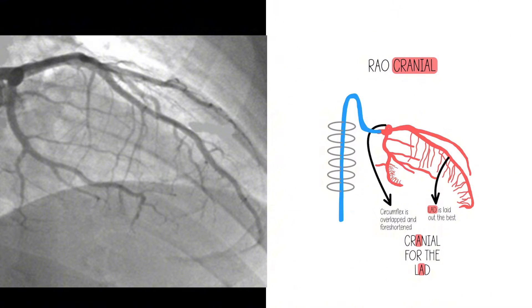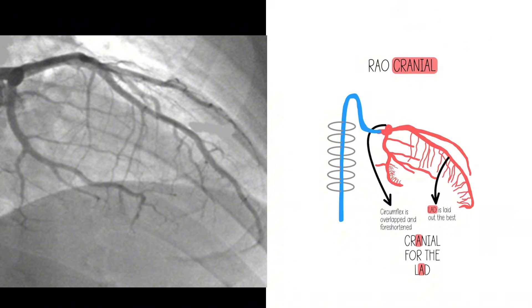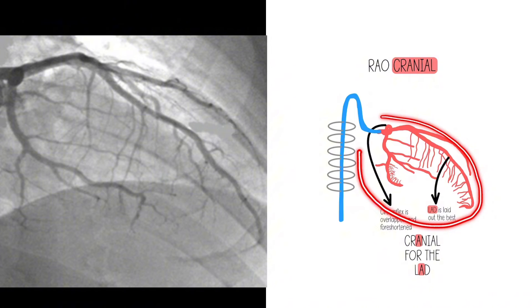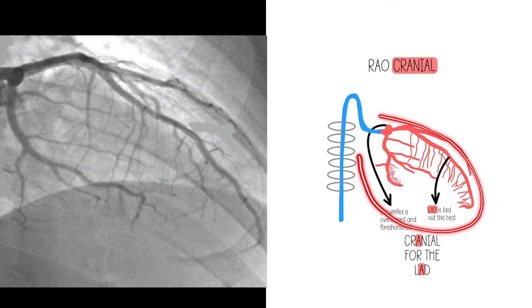Just to recap from other videos: how do you know that this is RAO? There are two ways. The first way is the spine — the spine is on your left hand side of the image, that is RAO. Versus if it was on the right hand side of the image, it would be LAO. The other way is by the outline of the heart shadow, which definitely looks like RAO — we use that for our LV grams, not this oblong LAO shape.